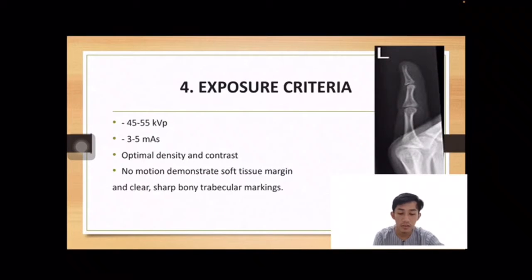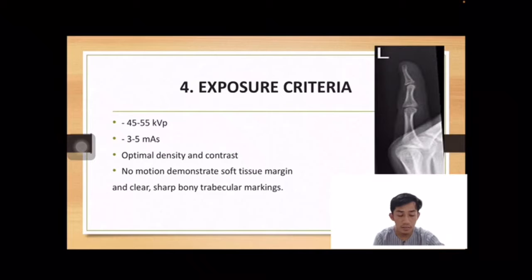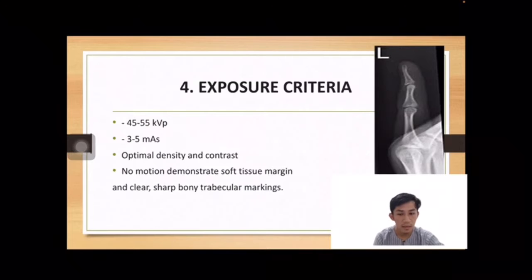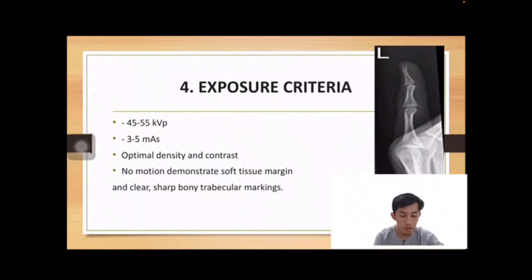Fourth is the exposure criteria. The exposure criteria describe how exposure factors or technique can be evaluated for optimum exposure for that body part.